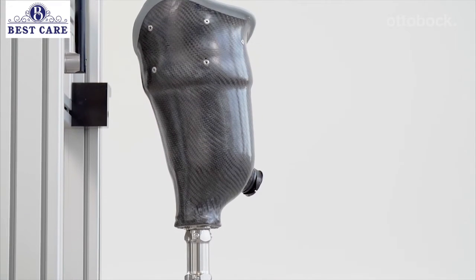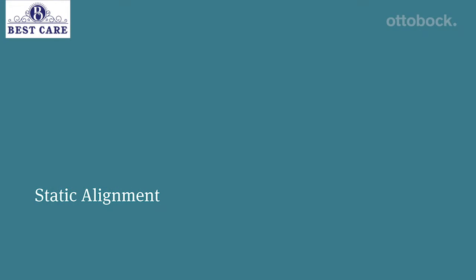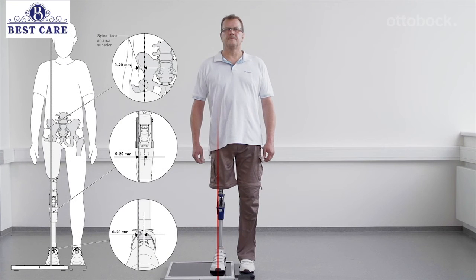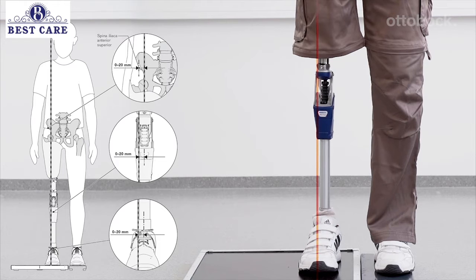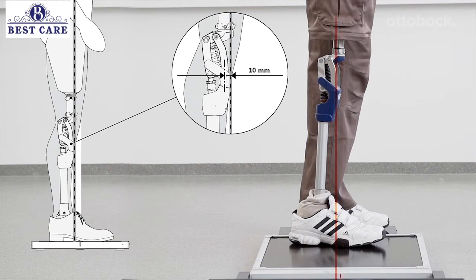For the correct bench alignment values, please refer to the displayed table. In the frontal plane, the alignment reference line runs through the middle of the prosthetic foot, the middle to outer edge of the knee, and the middle of the socket. The sagittal plane alignment should be adjusted solely by changing plantar flexion, so that the load line runs about 10 millimeters anterior to the knee axis.